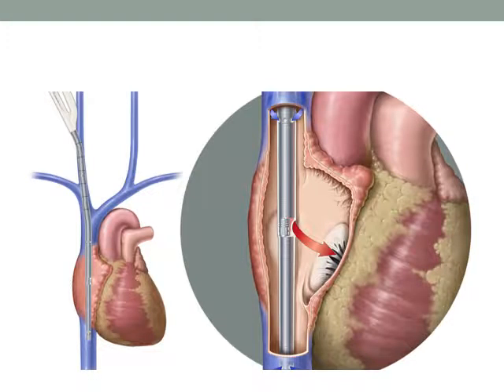And that's just more pretty pictures you can look at on your own. Now this is a patient we just recently did, and this is FemFem. This cannula on the patient's right is stopping right there in the region of the hepatic IVC. That's the drain. The other cannula that's longer and positioned around the right atrium is the return. As it turns out, the cannula we're using there has a radiolucent tip, so the tip of the actual cannula is a little further out than what you see. They're not quite as close. So that's the return, and the other one's the drain.